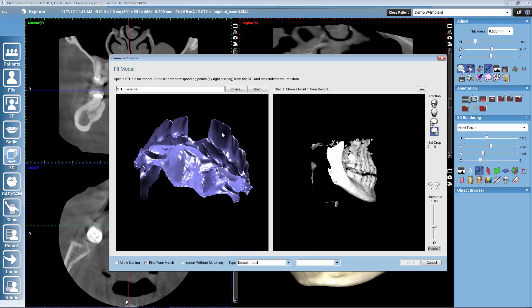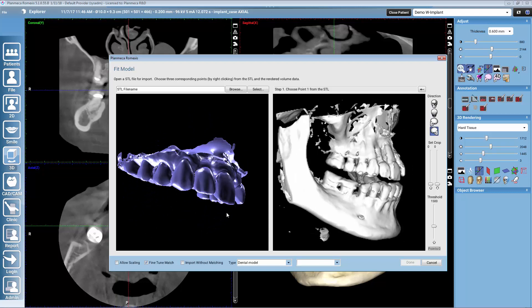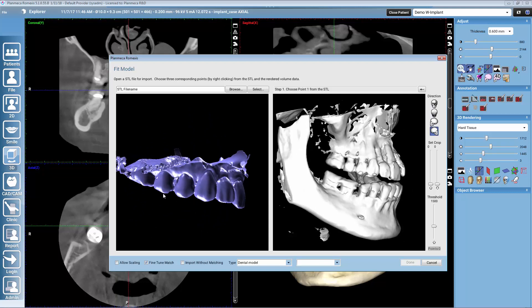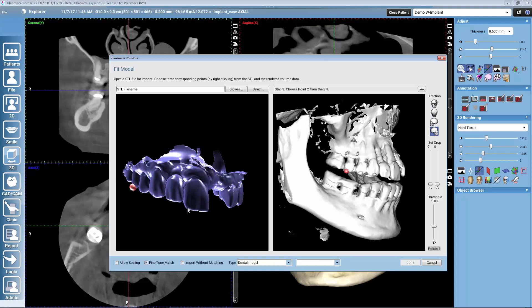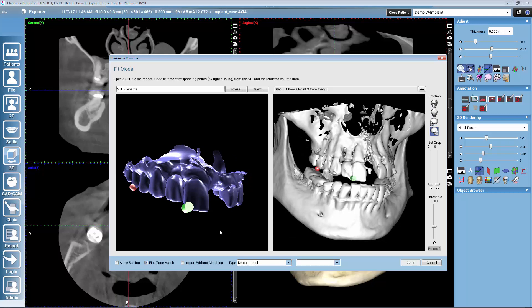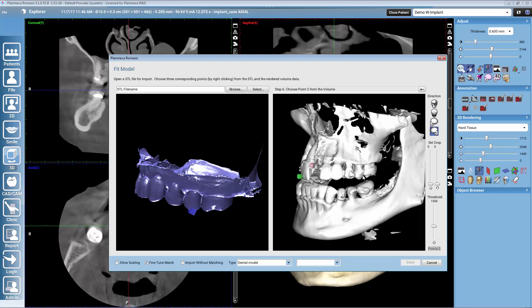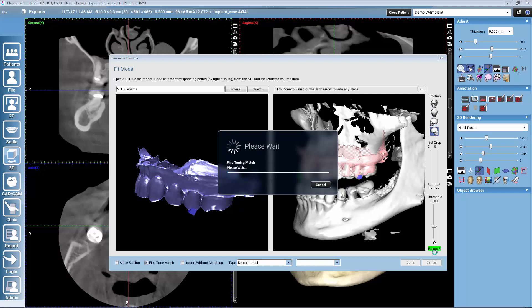We need to give three points in common for Romexis to do the mapping. We try to select the points as far away from each other as possible, always selecting one point from the left side image and then the same from the right side image. Romexis will not only use the three points given, but it will use a special algorithm to make the match even better.